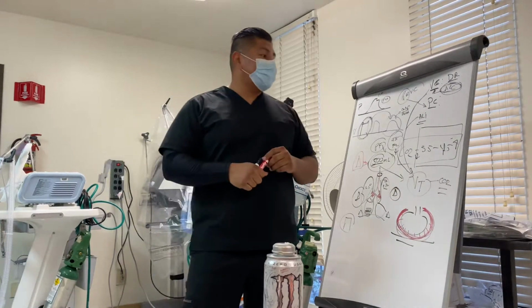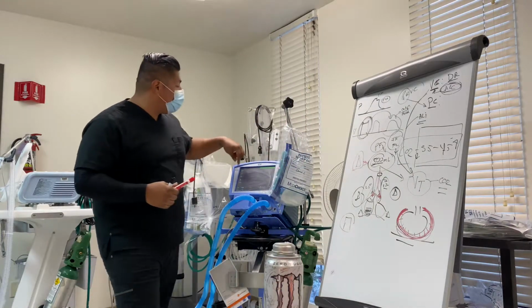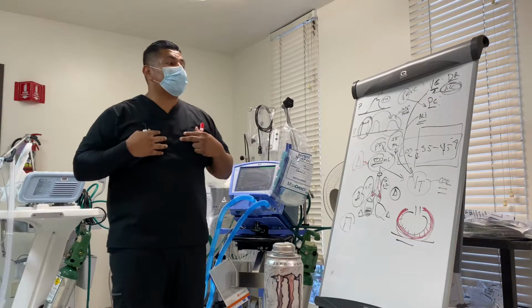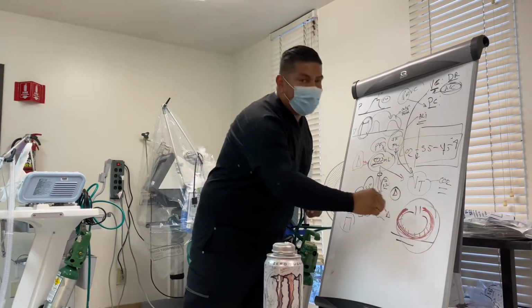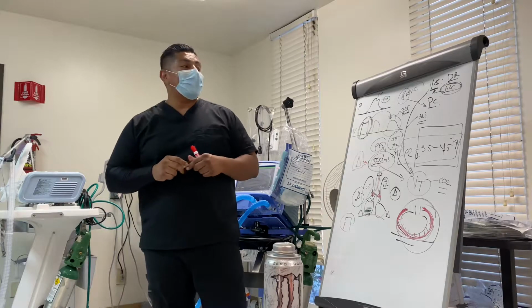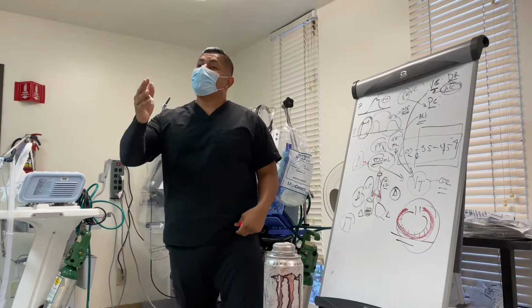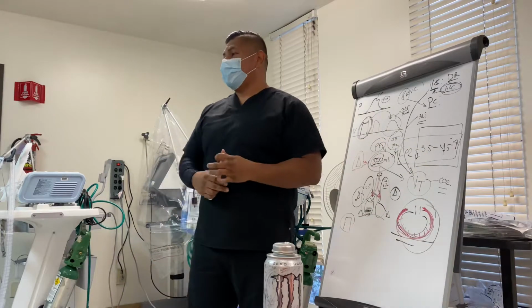Why is this important? Because the less peak inspiratory pressure you have, the less intrathoracic damage you'll have, and the less barotrauma you'll cause the lungs, which will lead to less alveolar or micro damage. This is why volume AC is more of an old school thought now. But the doctors love it because they can control CO2 directly.